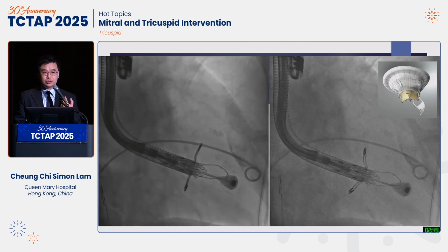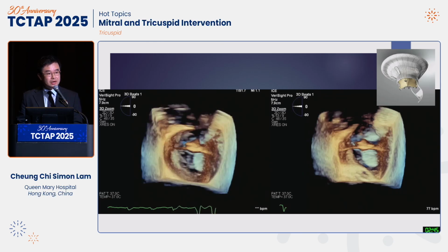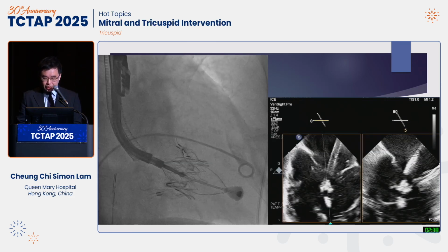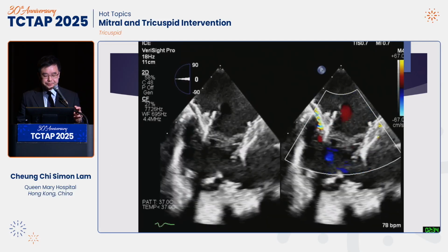So the replacement goes transjugular using the LuX-Valve. You also need to visualize the anchors, the positioning of the septal tongues, and release step by step, also under TEE and ICE guidance. And this is how it looks.